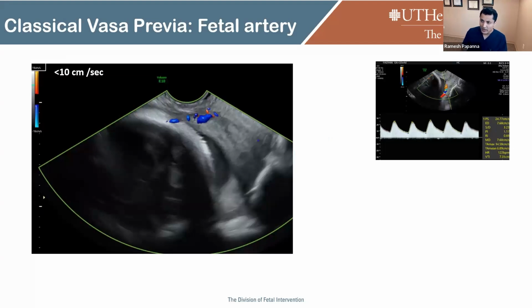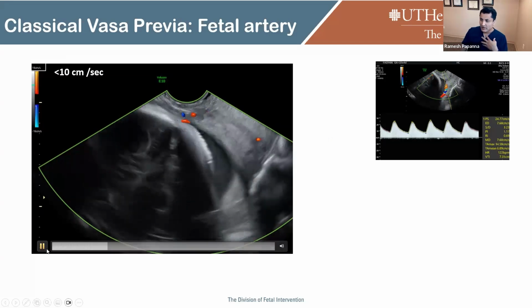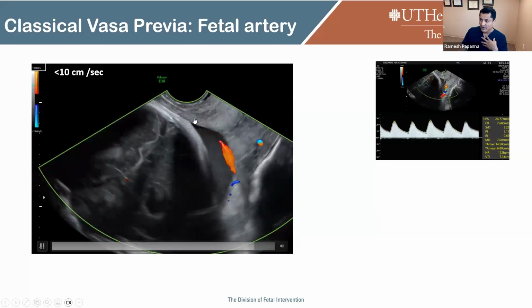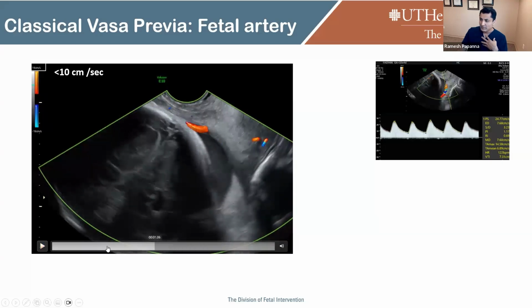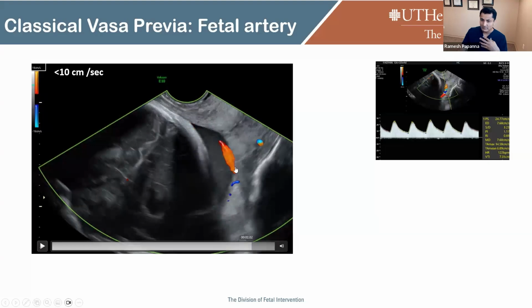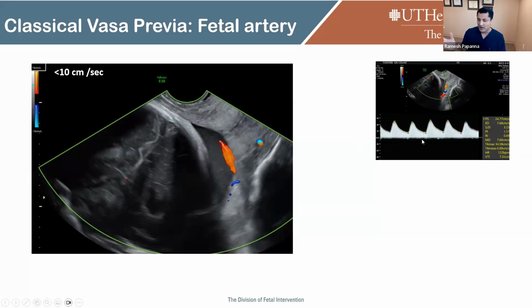So I have some clips here. These are real cases, and I want you to follow along with what I'm showing. Here is a transvaginal ultrasound of a patient, and here is at less than 10 centimeter PRF, and you can see the internal os comes into the view. This clip is quite fast, and you want to be a little bit slower than that. And you can see the internal os right there, and over that is a bright flowing vessel, and you do a pulse wave on it, and it's got a nice fetal heart rate. These are one of the most commonly detected Vasa previas, and they are the easiest ones because they pop in front of your face, because they light up because there's such a high flow.